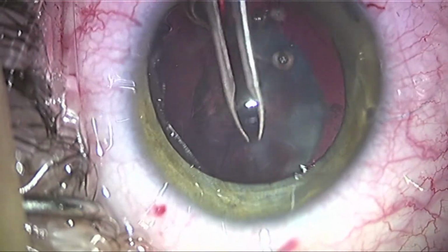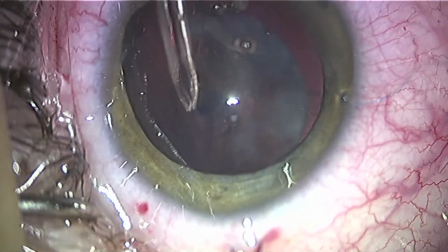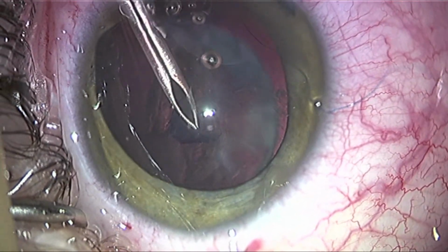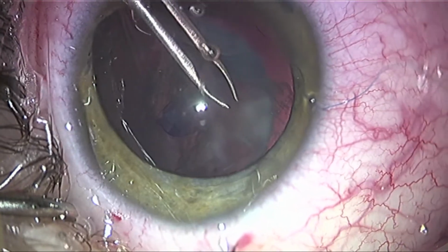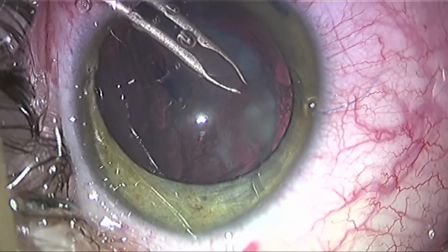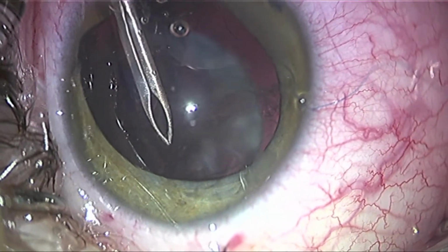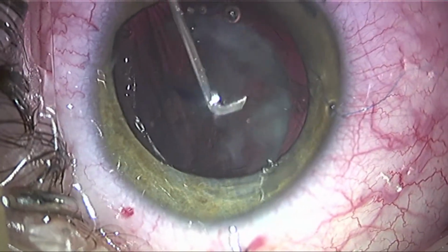This was a bit tricky because this capsule was not behaving like a senile lens capsule and it kept wanting to run out. I got into a little bit of trouble here with the lens capsule wanting to go peripheral and had to use a little rescue technique to complete the rhexis. You see here pulling towards the center, the capsule snaps, and we complete the rhexis. It ends up being round and continuous.